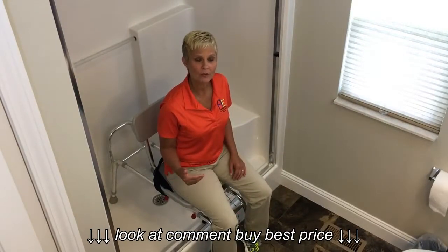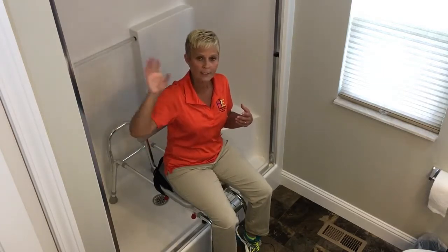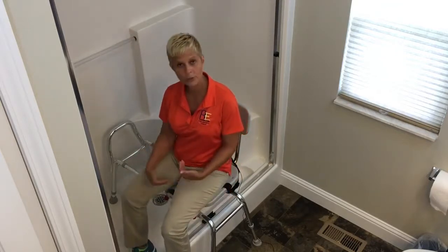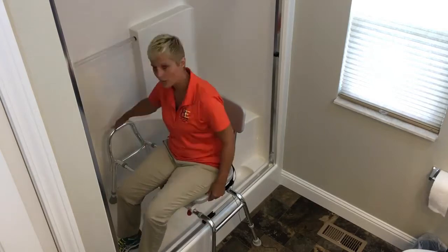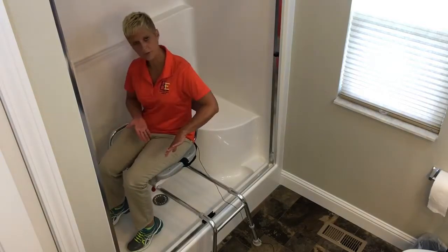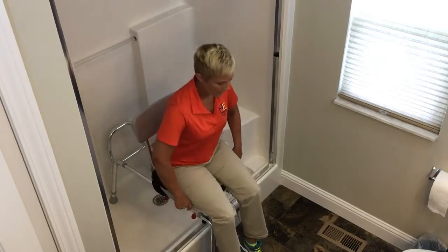Now we're going to demonstrate in a walk-in shower. This shower had doors, so I had to take those off — it would not work otherwise. I'd recommend a shower curtain instead. Back up on the outside of the shower to the bench and sit down. Take the lever, turn the seat, bring a foot into the shower, and the seat locks into position. Bring the other foot in, then press the knob to release the sliding button and slide yourself over — the seat clicks into place on the other side. To get out, press the lever on the right-hand side, give a little shove with your hips, slide out to the outside, and it locks into place. Use the swivel seat button, bring your legs out, lock the seat into position, and you're able to get up.